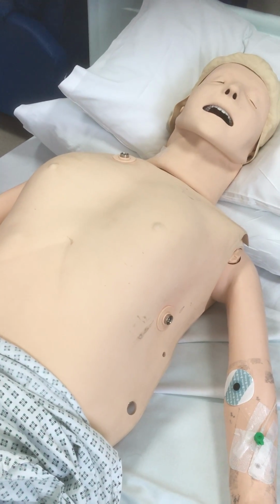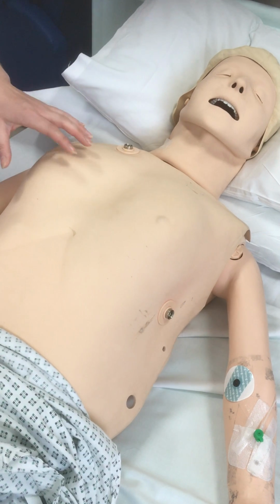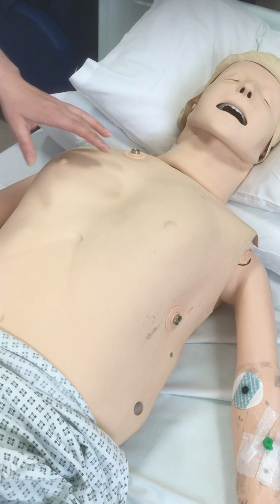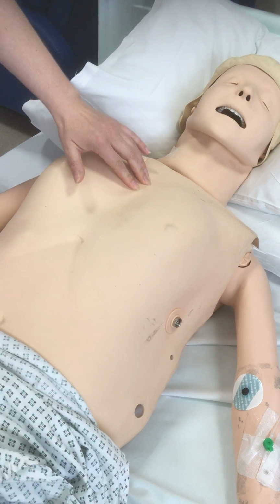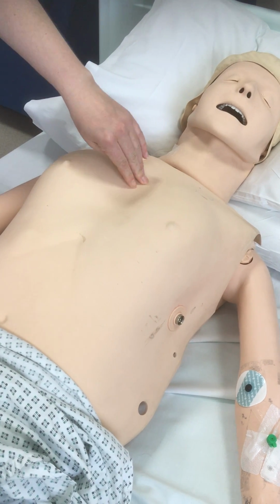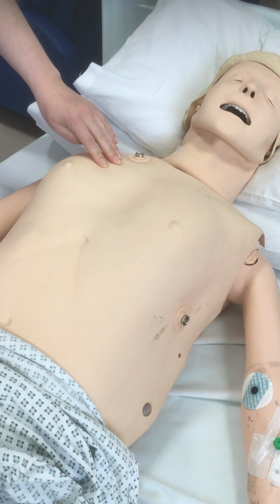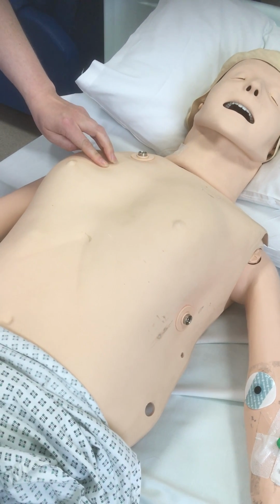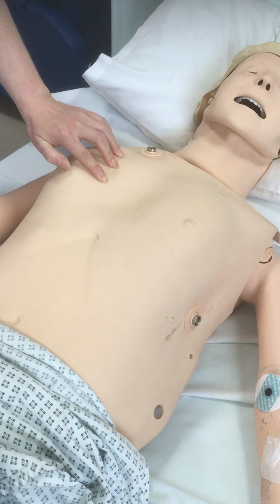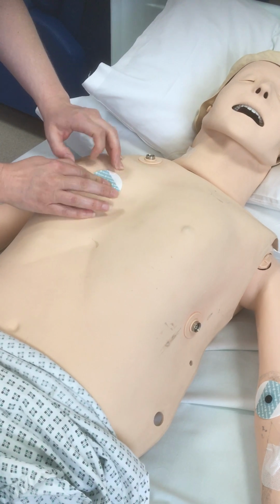When placing ECG stickers, it's important that V1 goes in the fourth intercostal space on the right side of the chest. The best way to measure that is to feel for the sternal notch in the centre of the chest. It's usually around about here, which is just a little lump. You feel across to the second intercostal space, and then you count down to 3 and 4. And V1 needs to go in the fourth intercostal space as close to the sternum as you can.